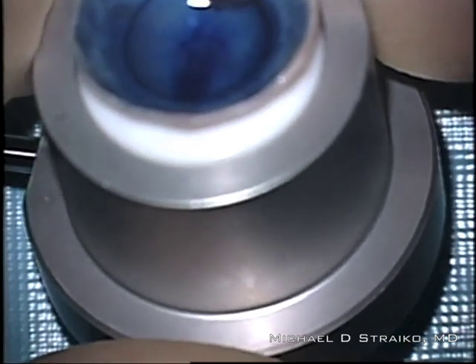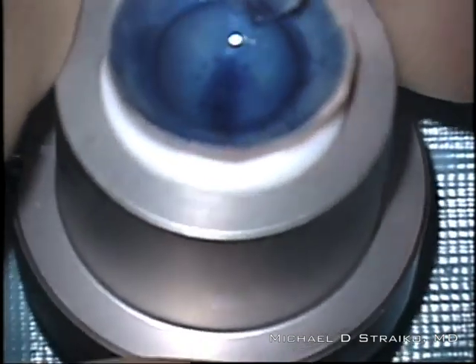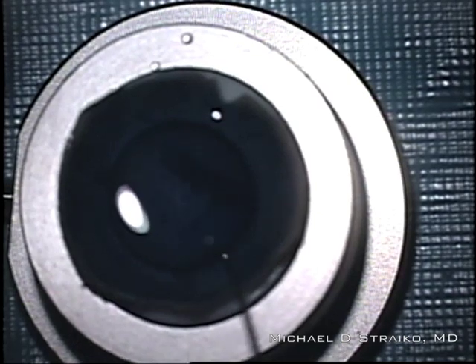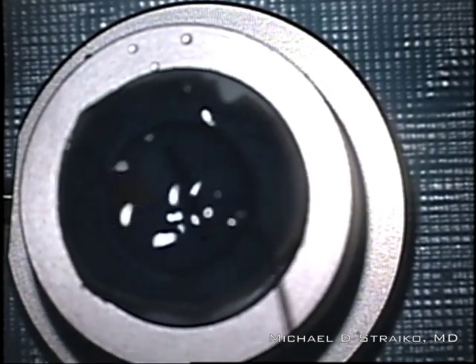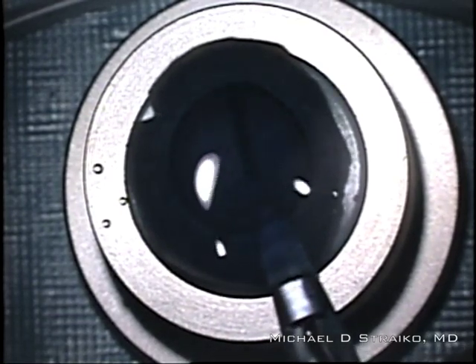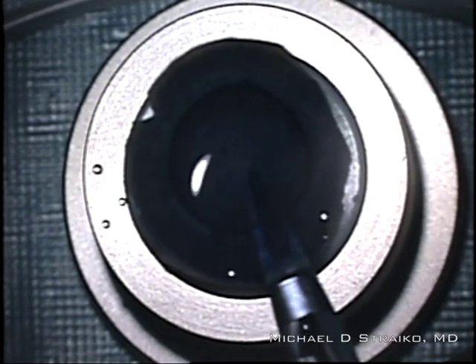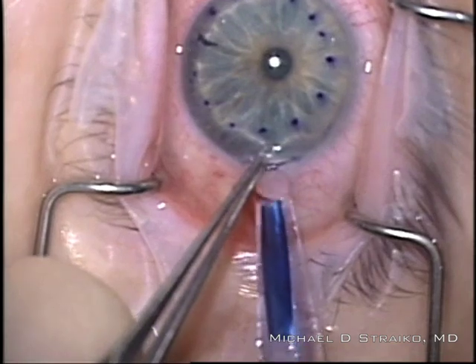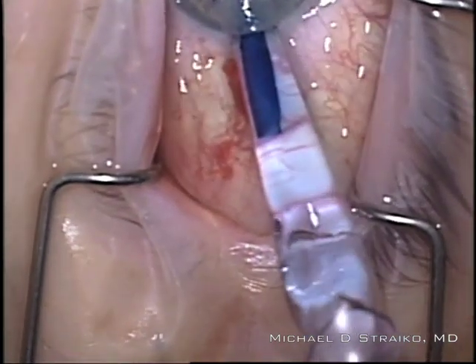Now I'm using a Merocel sponge to drain all the fluid away, taking care to stay away from the graft so that it doesn't stick to the sponge. I then float the graft in a pool of balanced salt solution and direct some BSS at the graft to try to get it into a double scroll configuration if possible. This one wanted to stay in a single scroll, so I just aspirate it straight off the punch block — I've only touched that graft once with forceps at the very edge. It's really a one-touch technique. Then I get the graft loaded in the injector and get it snugly into the eye.